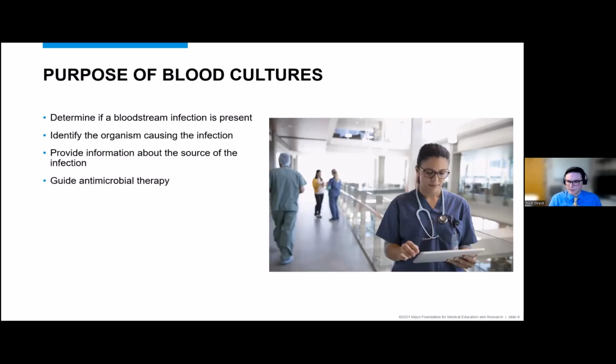And then also, as we do further testing, not only with the identity of the organism but with downstream susceptibility testing, we can contribute to the appropriate use of antimicrobial therapy. Not only making sure the patient is being appropriately treated, but also narrowing the spectrum of antibiotics used following empiric therapy, so that we promote good antimicrobial stewardship.